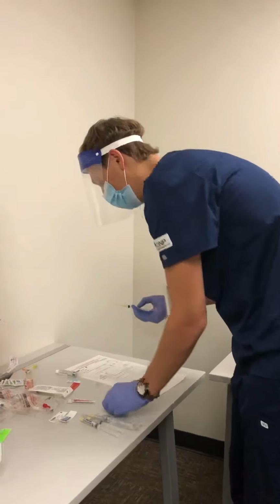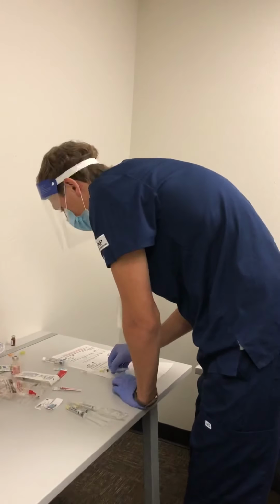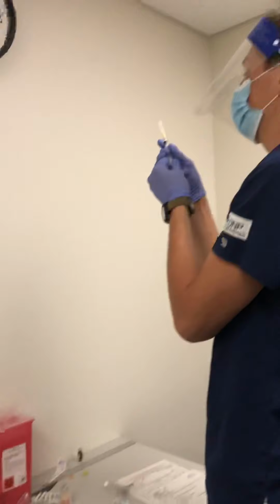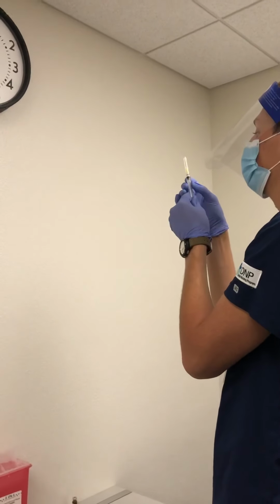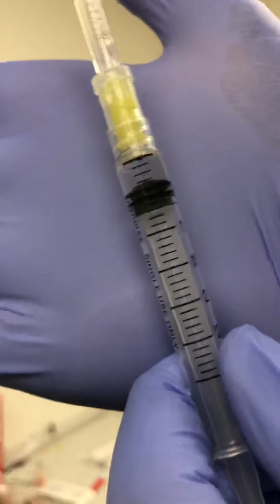And then this needle can go in the medication disposal bin. Cap this. Make sure that my air bubbles are out. Okay. I'm just going to make sure that the 0.4 is there.